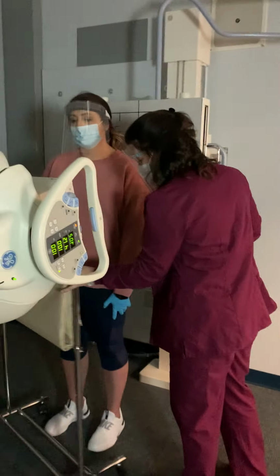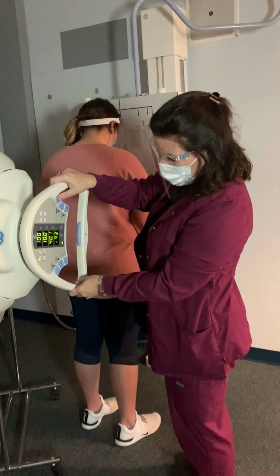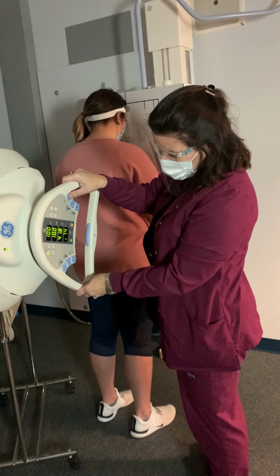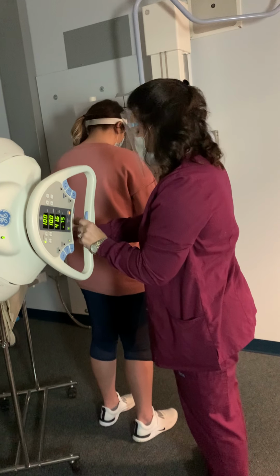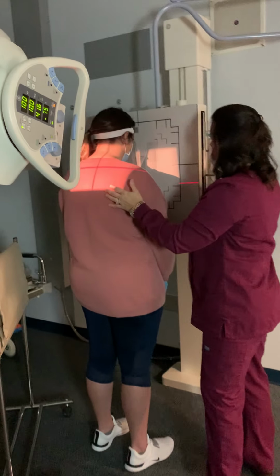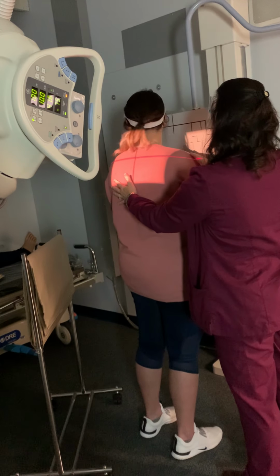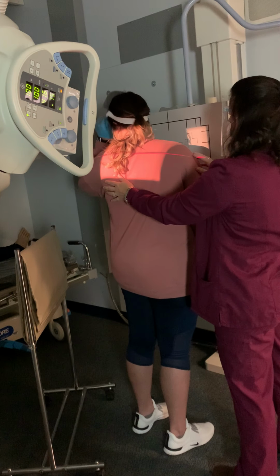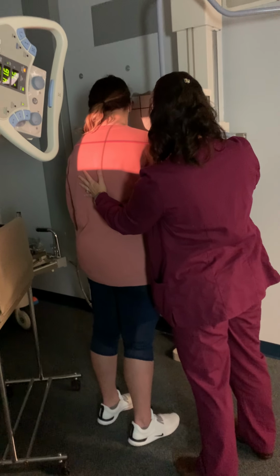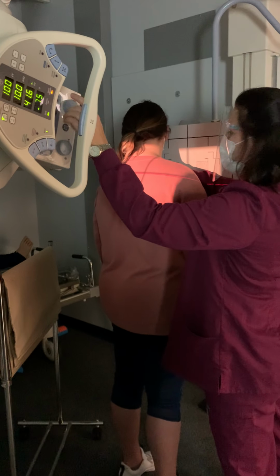So, I'll flip you around real quick just to show them that. We'll do the right. So we'll go 15 degrees. Caudal. So all the way up against here and turn your head to the left if you can. You might have to take your face shield off because it's kind of pulling you further away. There you go. Step to your left. Going. I still got to find the jugular notch.